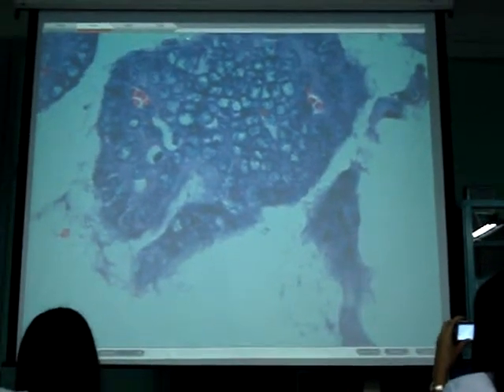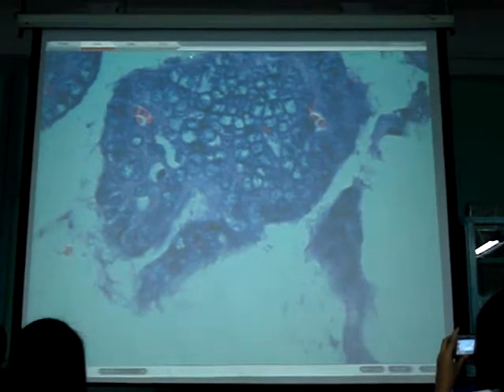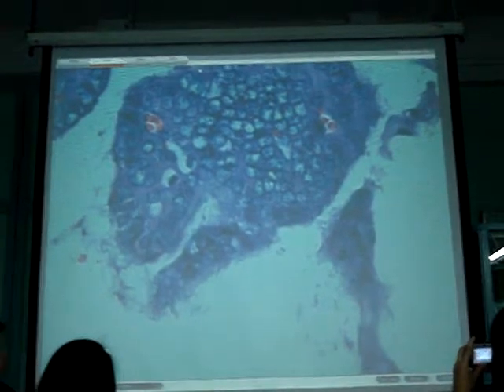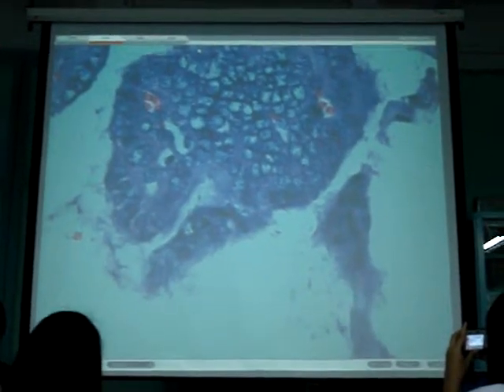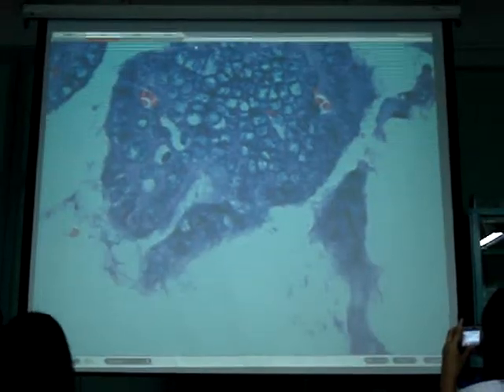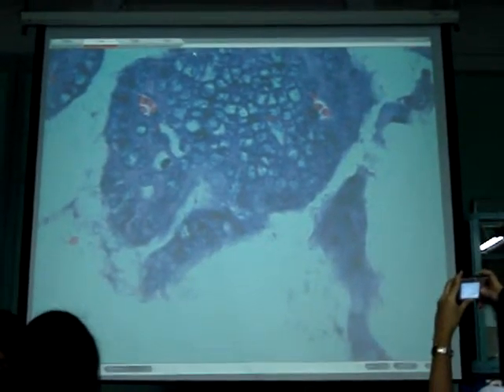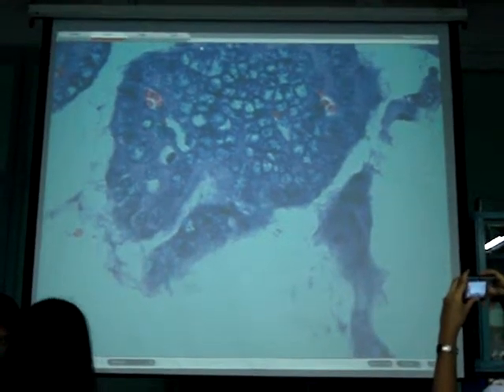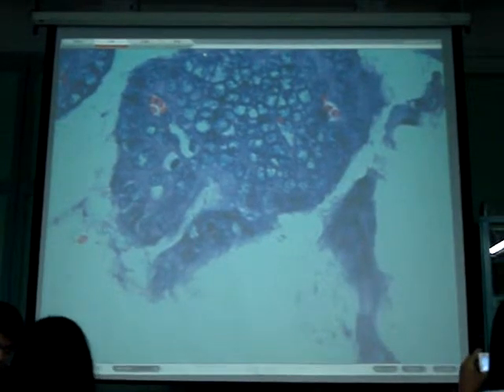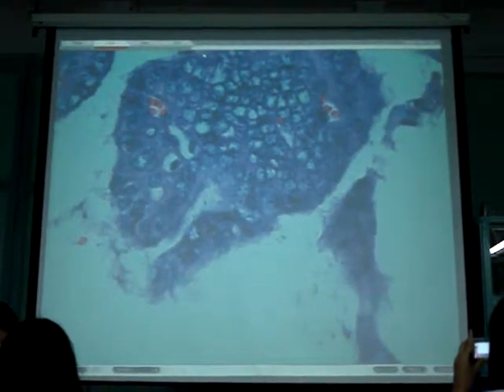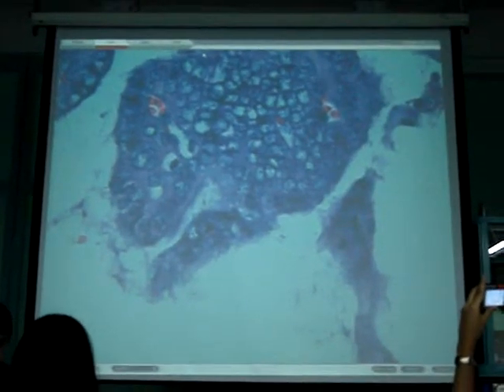Cytoplasmic inclusion. So, to summarize papillary carcinoma: architecturally, you see papillary formation that is arborizing, and it is supported by fibrovascular stroma. Cellularly, the characteristics are Orphan Annie nuclei or ground-glass appearance of the nuclei, nuclear grooving, and palisading. And since this is a malignant tumor, you see differences in sizes of the cells — that's pleomorphism or anisocytosis of your cells.